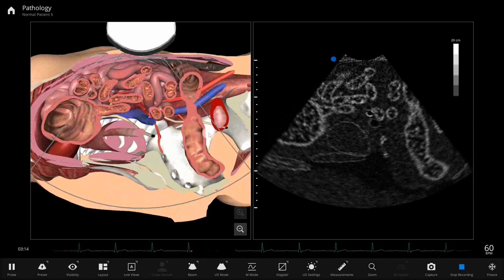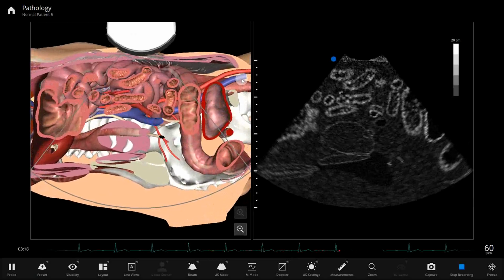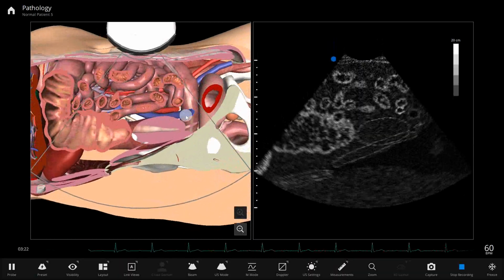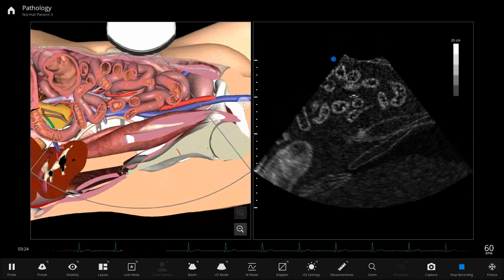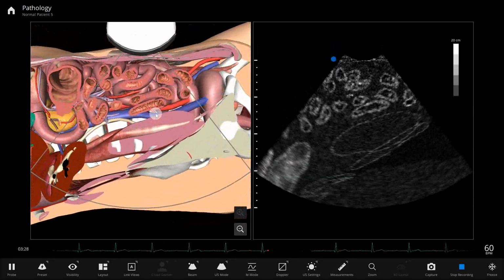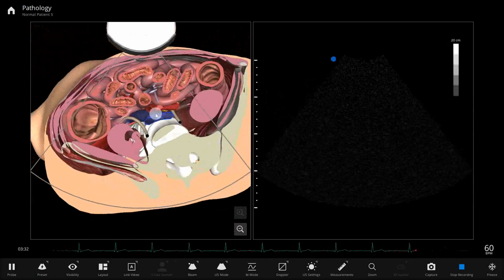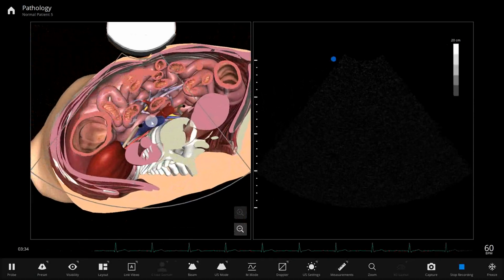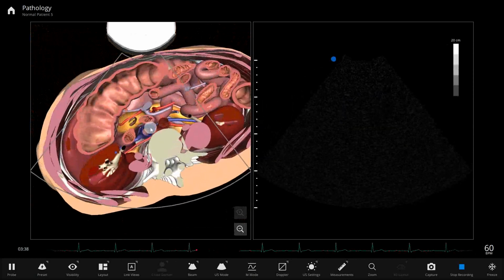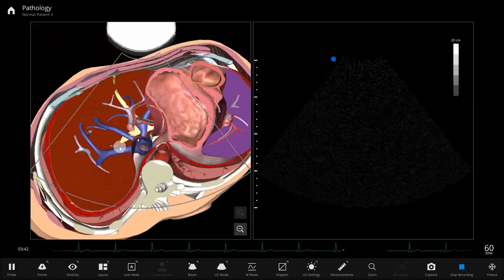If I turn, you can see the left one heading down to the left leg right there. And then if we turn on this right one, there we go, you'll see that right one heading into the right leg. Okay, that pretty much covers the IVC. Those are the main branches you want to know about. You want those iliac vessels. You'll want to see the renal veins. There we go. And then you'll want to see those hepatic veins.